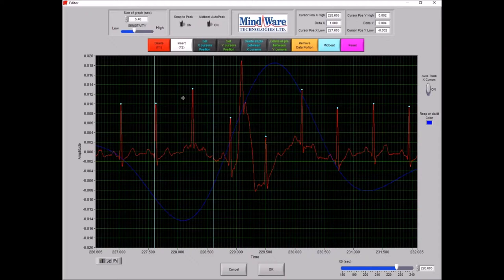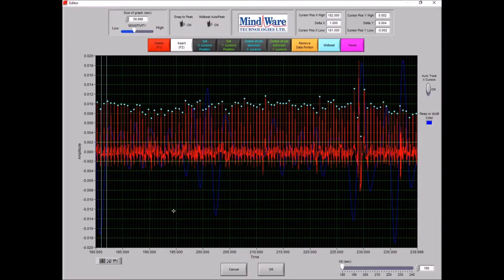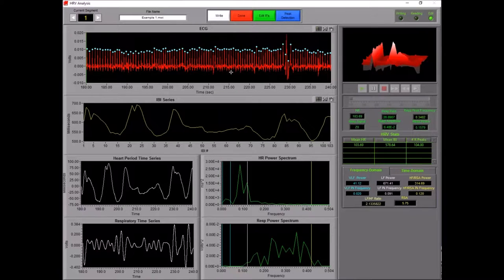Before exiting this segment, I'll zoom back out to see the full segment and make sure no other edits are needed. I'll open the zoom palette and choose the zoom-all option in the lower left corner. Now we've returned to the full view and all the R peaks identified on screen have blue dots, meaning we're done editing and can exit the editor. I'll press OK, and the analysis screen is now updated with our edits, and the RSA value is correct for this segment.